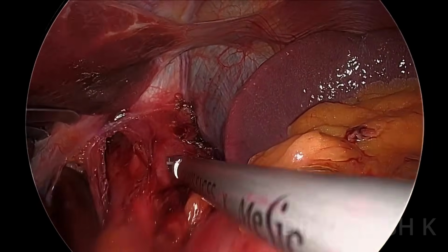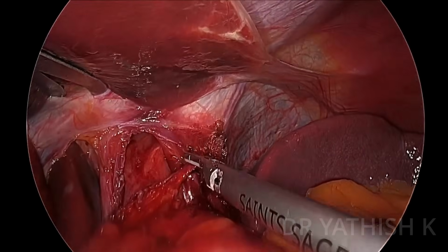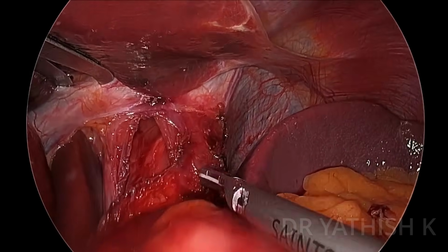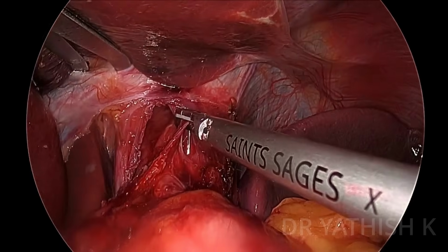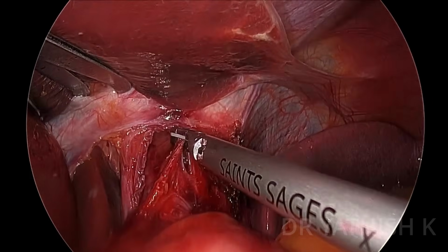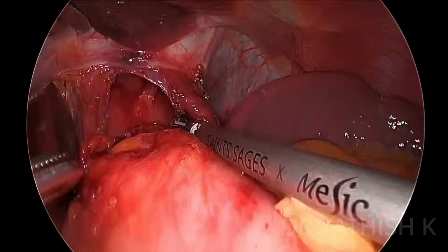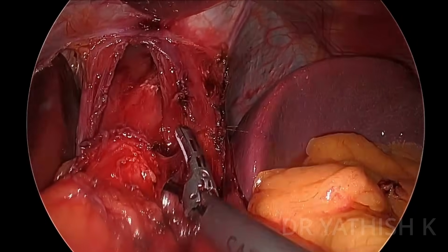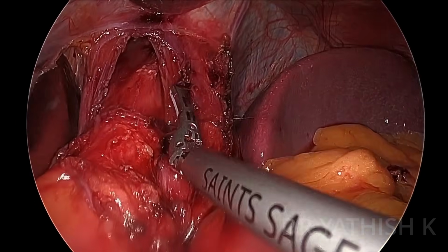Circumferential mobilization of the esophagus is of utmost importance, because you don't want undue traction by these structures, which will pull the esophagus up and lead to a wrap disruption in the postoperative period. So you should have utmost patience when you do this esophageal mobilization.